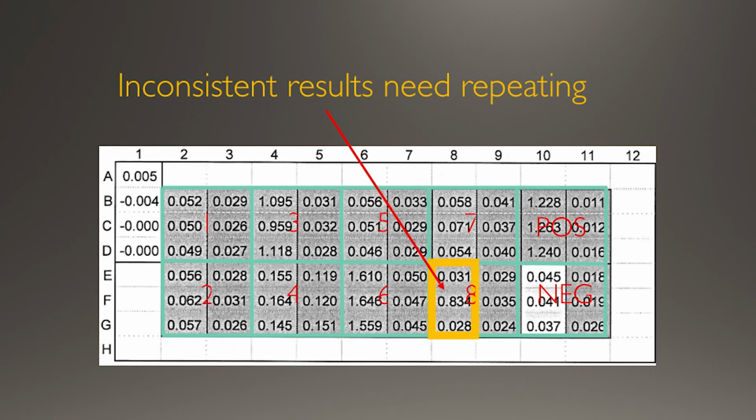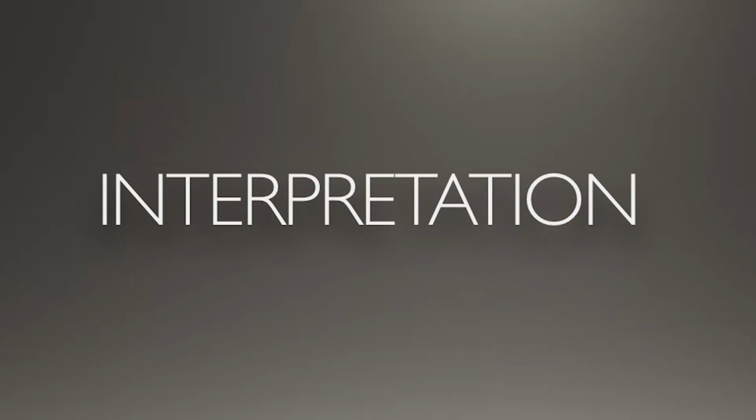Always examine the results closely. If a sample has, for example, 2 viral antigen reactions with low optical densities and one that is clearly very high, this likely indicates an inconsistent well, and you should repeat the sample. Failure to do so may result in a false positive and unnecessary confirmatory testing.